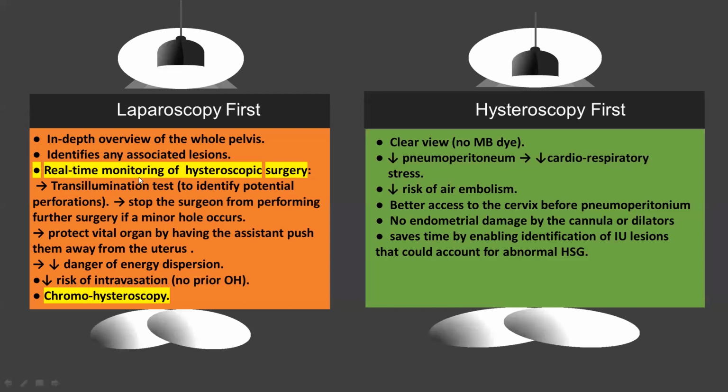Because it gives us an in-depth overview of the whole pelvis, identifies any associated lesion, and it has the advantage of real-time monitoring of hysteroscopic surgery, which includes trans-illumination test to predict perforation, protect vital organs by having an assistant push them away from the uterus, and decreasing the danger of energy dispersion.